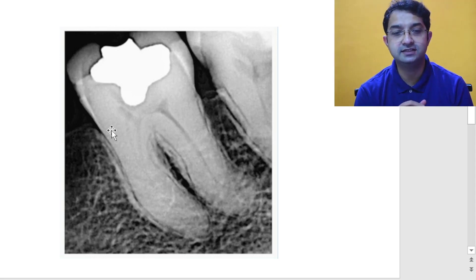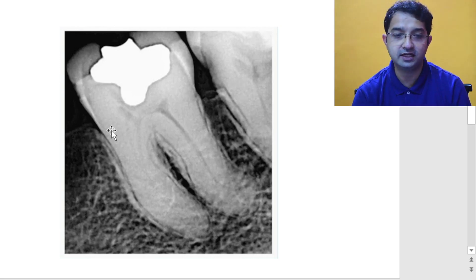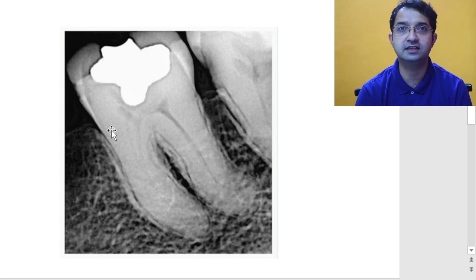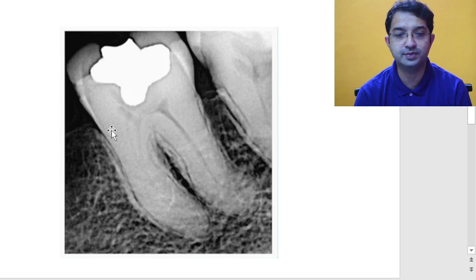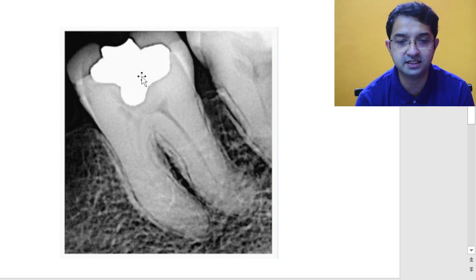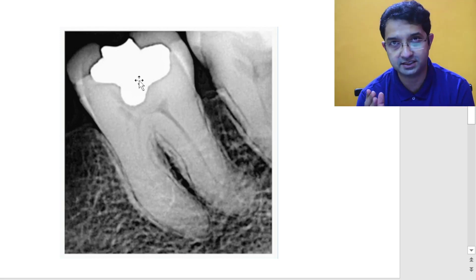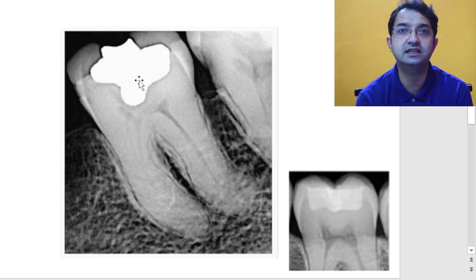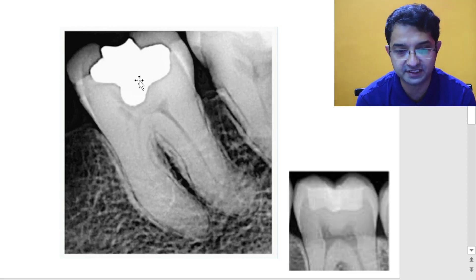As you can see, this is an image of a first molar and obviously all of you can make out that there is a radiopaque restoration. Generally when you have this much amount of radiopacity, it indicates it is either an amalgam or a cast restoration. A composite would be slightly less radiopaque than what you have seen here.